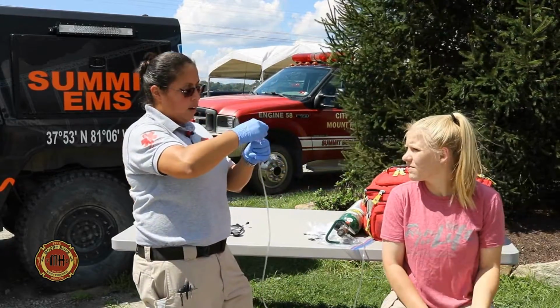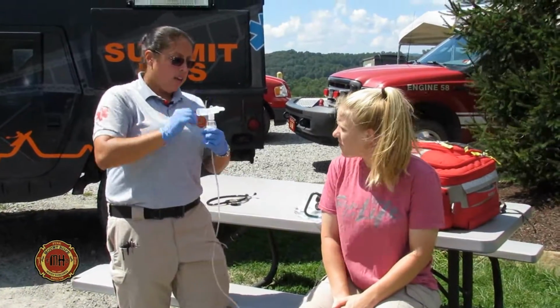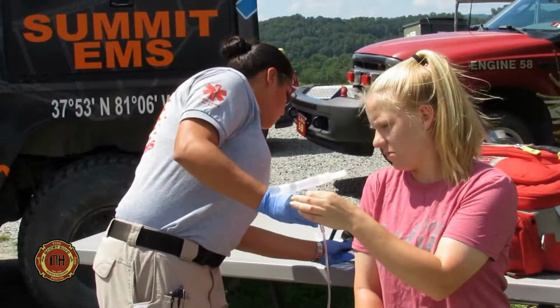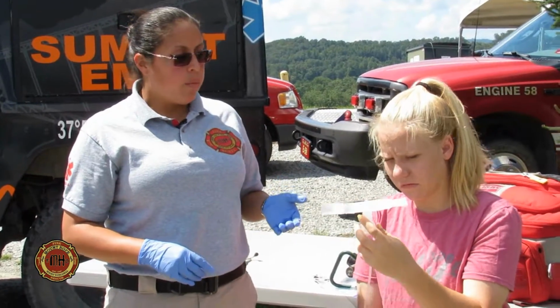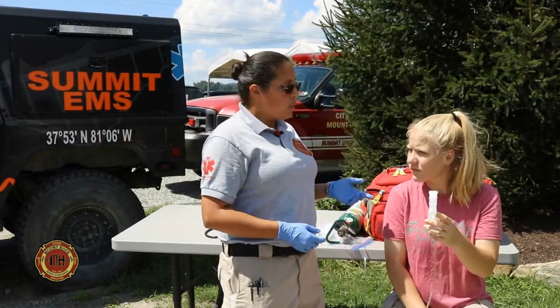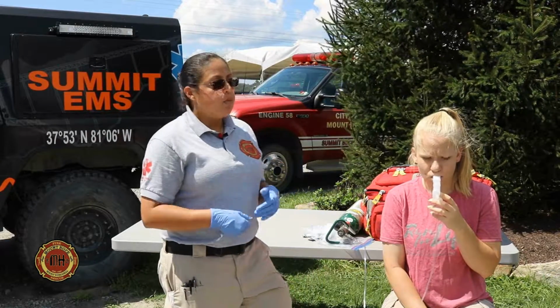And you'll put the top back on. And then you'll attach the top piece to this piece. And you'll turn on your oxygen to 8. And you want to make sure that your patient can hold it and that they know how to properly use it. So you want to make sure that you instruct your patient to put their mouth over the mouthpiece and make sure that they have a nice good seal and are taking nice deep breaths in.